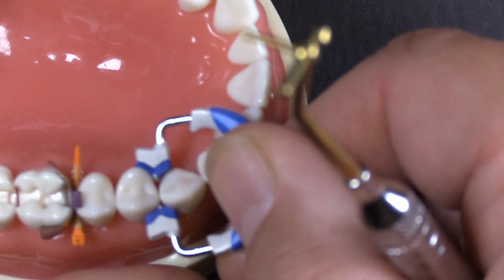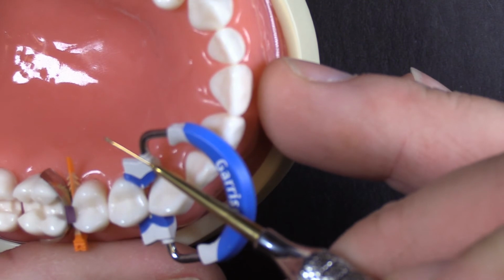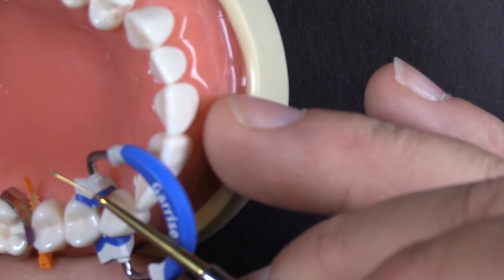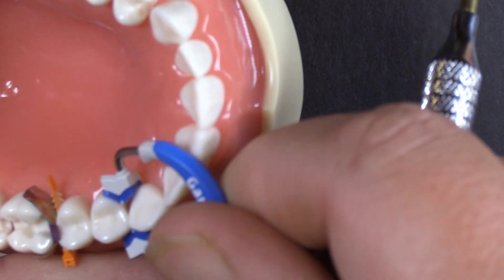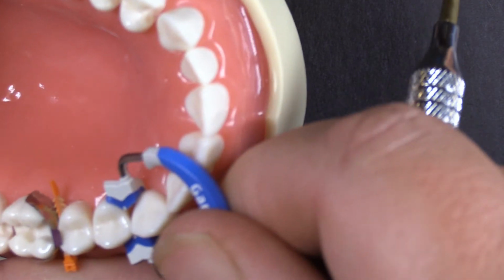It will grip there. Again, it's kind of the same situation as what we looked at with the pedo model. On that canine, what can happen is if this doesn't have a very pronounced bulge there, there's not much for that ring to grip. So you've got to eyeball that a little bit and make sure that it's going to stay seated.